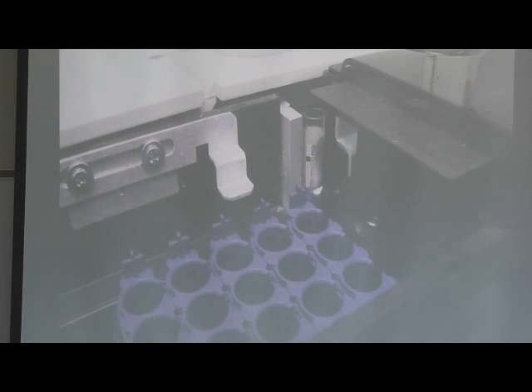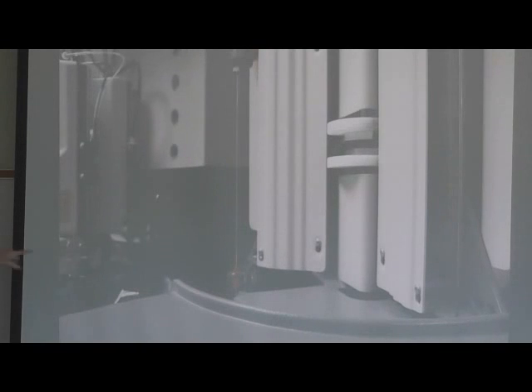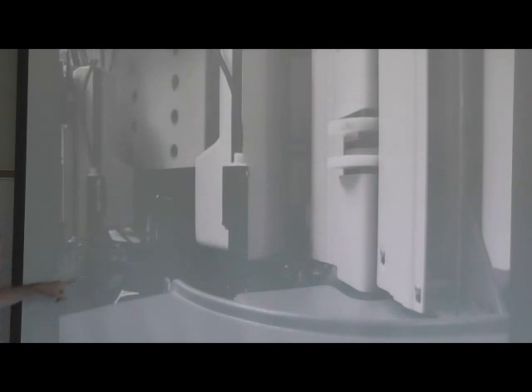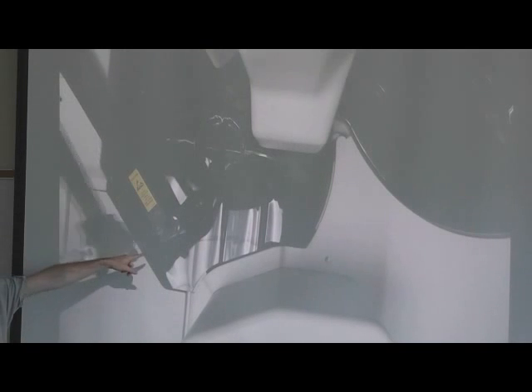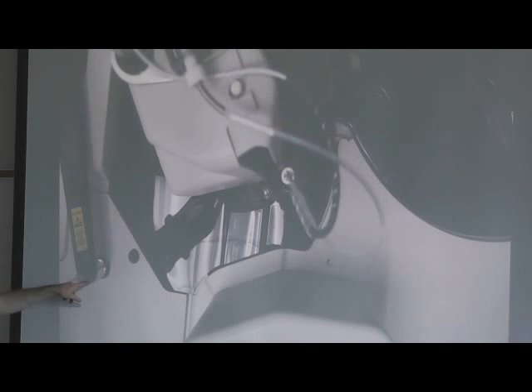You notice it gets red all the time. Did you see any of the samplers yet? So you see that? It's like dipping down into a sample, or it's washing the pipette tip, and then it goes into the sample. Draw some sample up into the machine, and then it's going to wash. I can't tell which one is which, but it's doing one and the other. So what do you think an issue is with this where you're not changing pipette tips?